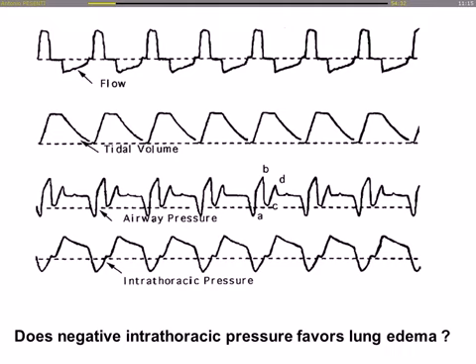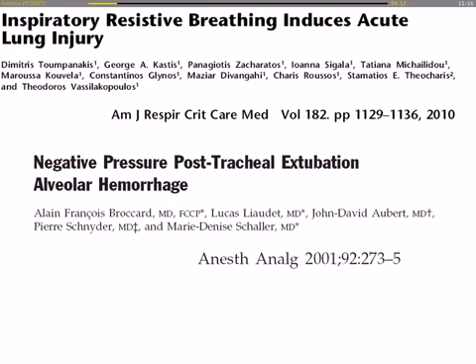Because if the patient tries to breathe against an increased resistance or a stiff lung, sometimes that is not very good. And we have some other indications in literature that that is not good. You just heard, I don't have this slide here, the recent paper from Yoshida on Critical Care Medicine this year, showing how deep and how high the respiratory drive can be in these patients.